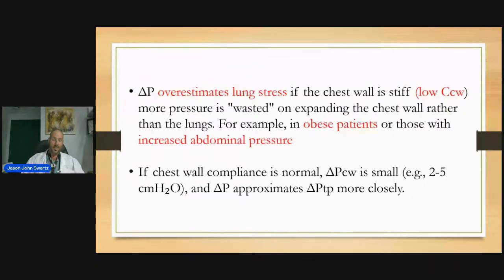You want to be thinking of setting the PEEP, whether you have the transesophageal balloon with these patients where you think that there is obesity or alterations in pleural pressures, whether you have access to the balloon or if not, these are probably the patients that you should set an optimal PEEP with electrical impedance tomography.